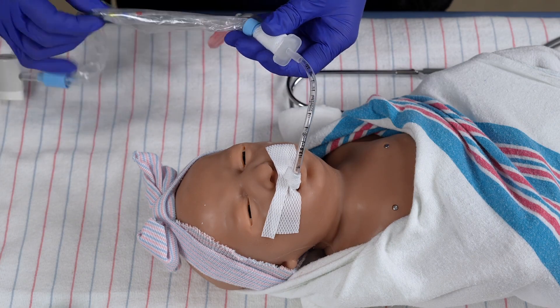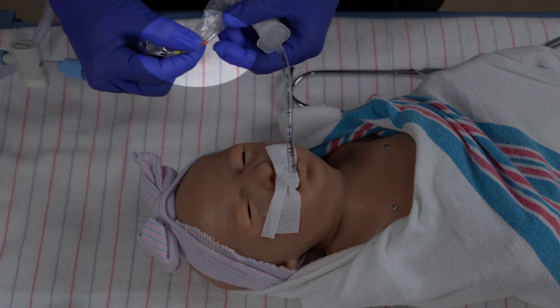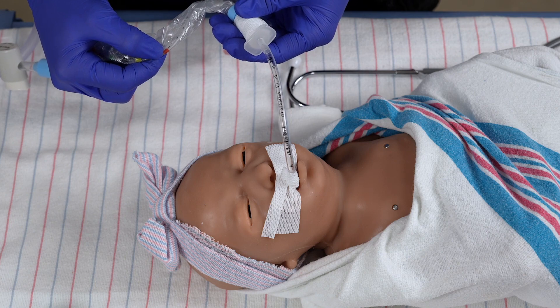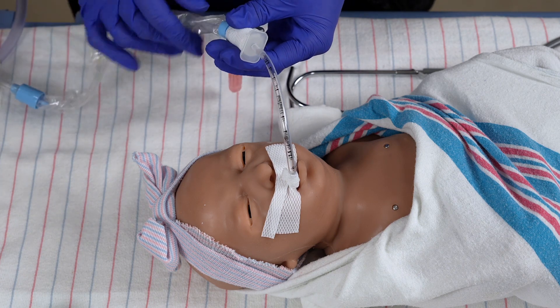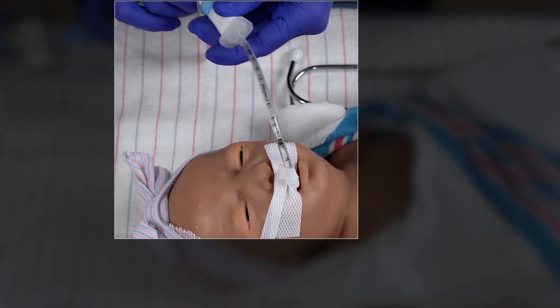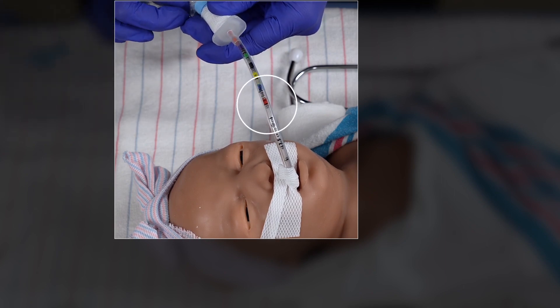For this scenario, we will suction to the number 12, or the number highlighted in red. Suction depth should not exceed the length of the ET tube or the adapter, as this can cause damage to the carina and surrounding tissues. While ensuring the tube is stable to prevent accidental dislodging, insert the inline suction swiftly to the predetermined number.